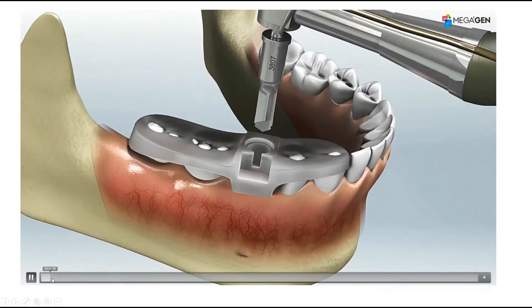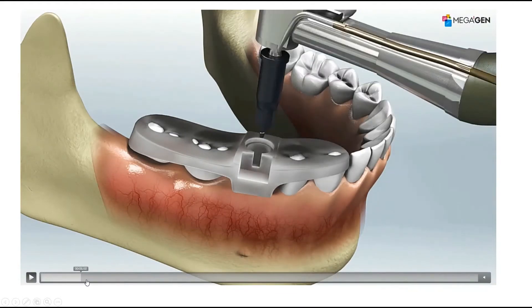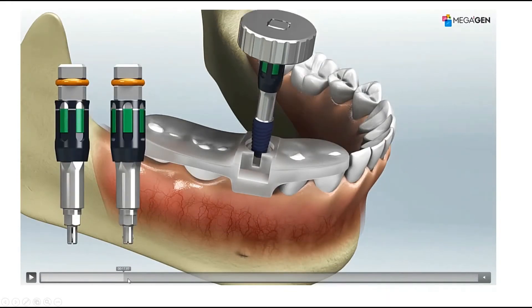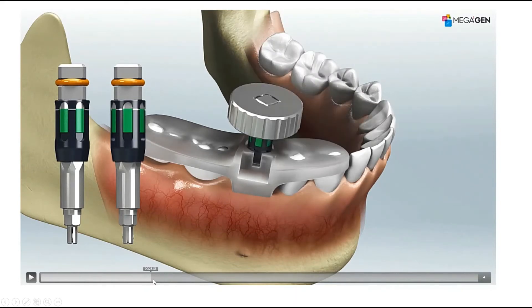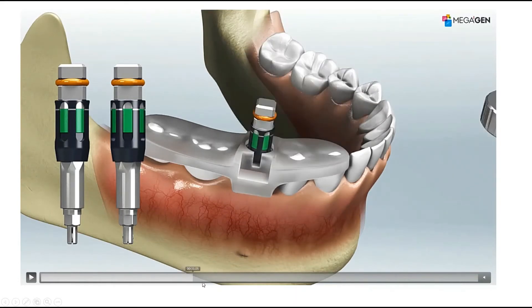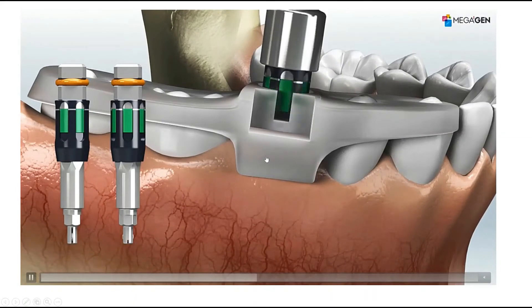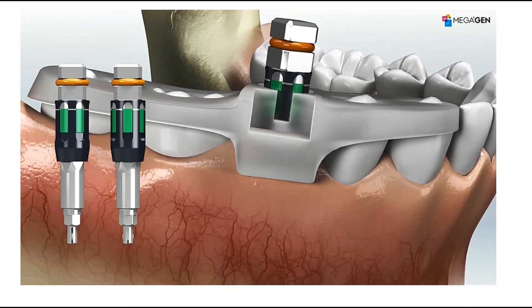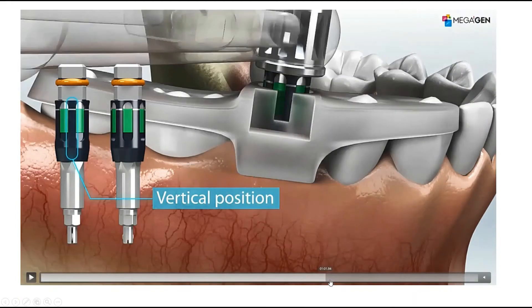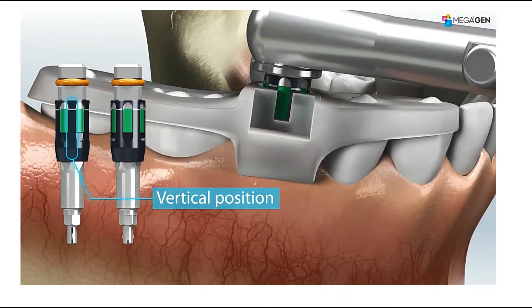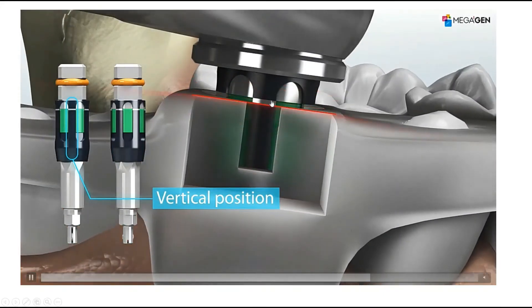In this video we're going to be using our surgical guide for drilling. I'm drilling directly through my surgical guide, and when it comes to implant placement, I'm placing my implant through the surgical guide. I prefer to place the implants first by hand and then place the implant with the handpiece. When placing the implant with the handpiece, always stop about one to two millimeters before the final depth. Then start to use your torque ratchet, bearing in mind that the first rule to apply is the vertical position or the depth of the implant. This will be the proper depth of the implant that I planned for.